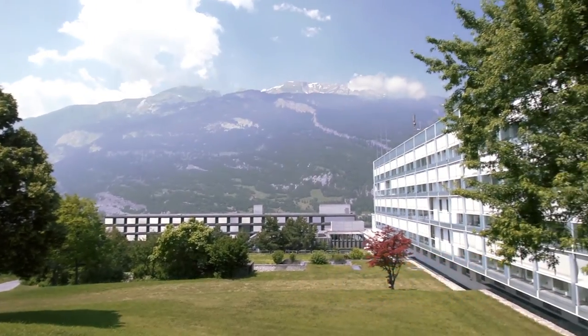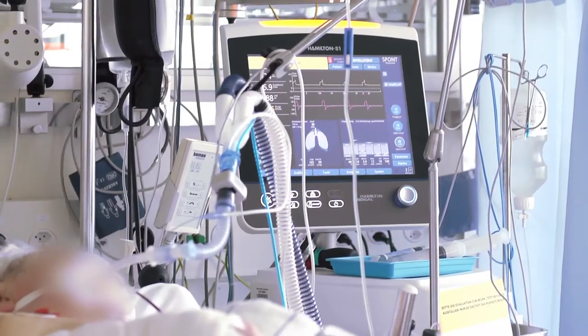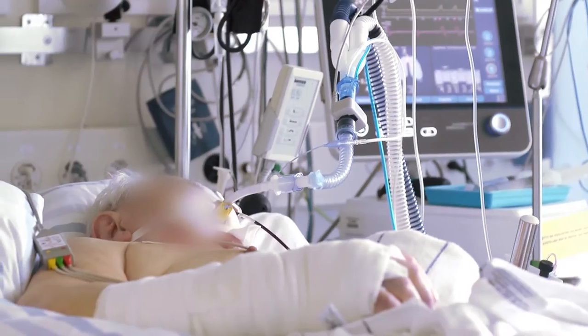In the intensive care unit of the Cantonal Hospital Grisons in Chur, Switzerland, the Hamilton H900 is the top choice for humidifying the breathing gas for ventilated ICU patients.